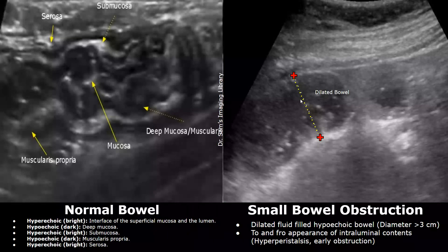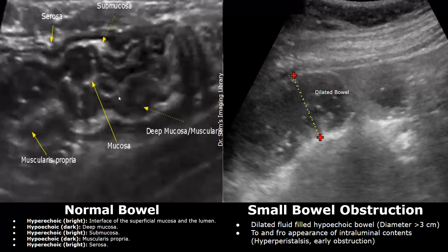In this normal image of the bowel you can see five distinct layers. The innermost hyperechoic layer is the mucosa — the interface of the superficial mucosa and the lumen. The second layer is hypoechoic deep mucosa. The third layer is hyperechoic submucosa. The fourth layer is hypoechoic muscularis propria, and the outermost hyperechoic layer is the serosa. The layers have alternating hyperechoic and hypoechoic echogenicity.